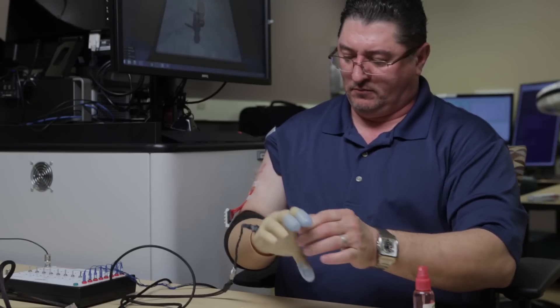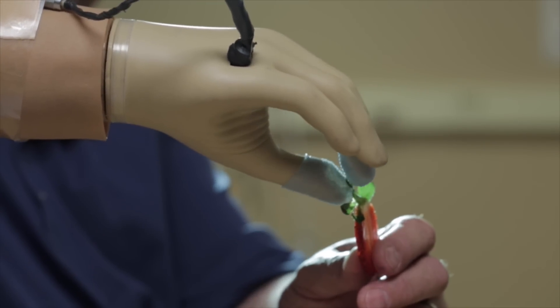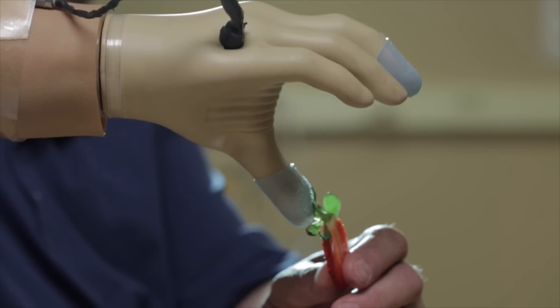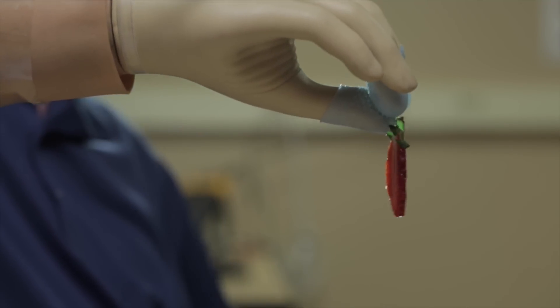Over the past probably decade, there's been a big push to improve the mechanics of the hand, thinking that would improve prostheses. But unfortunately, without sensation, it doesn't matter how good the hand is — you still can't perform at a human level.